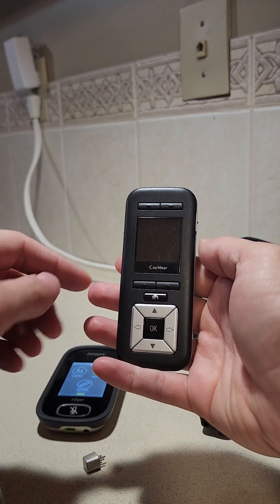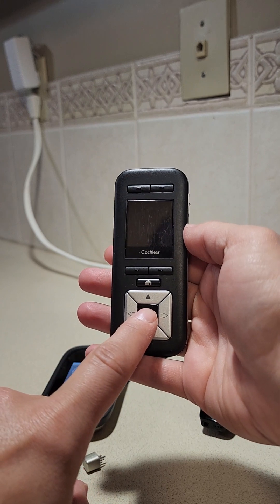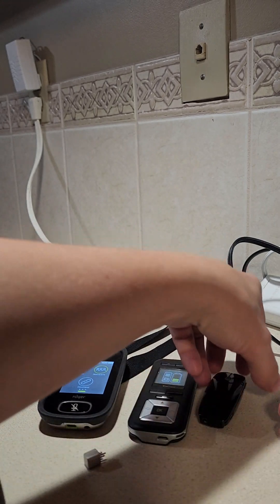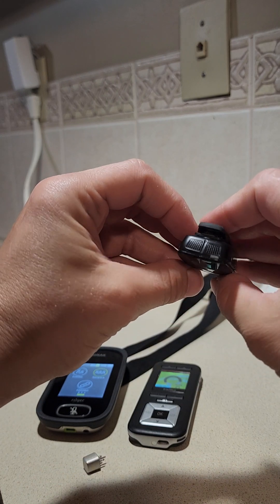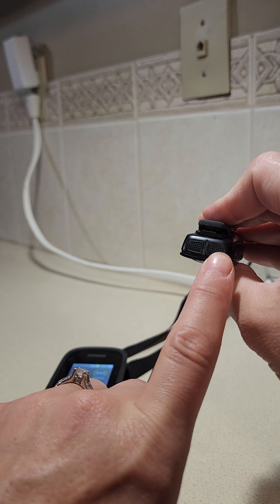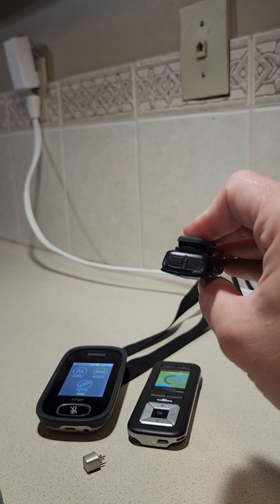The remote assistant gets turned on by pressing OK until the screen comes on. The Mini Mic 2 Plus from Cochlear has a gray button on the end — press and hold that until the green light comes on, and that will turn it on.